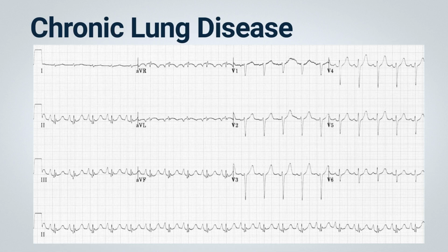Patients suffering from severe chronic obstructive lung disease, specifically emphysema, often display a relatively distinctive set of electrocardiogram findings. These include low QRS voltage, slow R wave progression in the chest leads, a vertical or rightward QRS axis in the frontal plane, and right atrial overload.